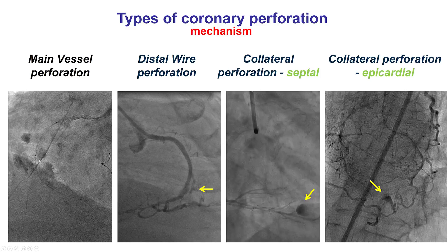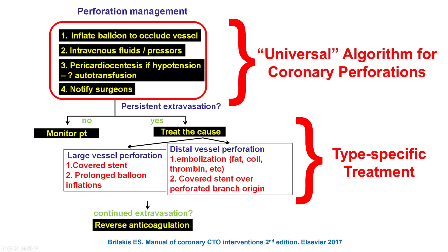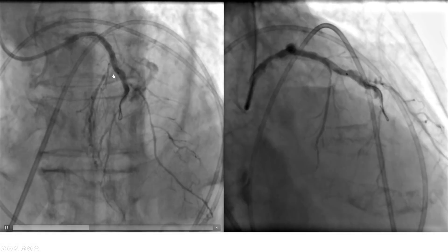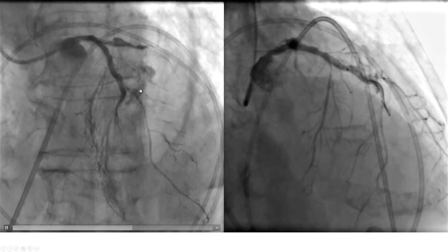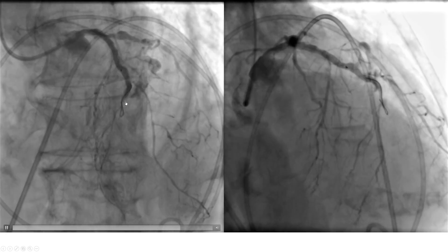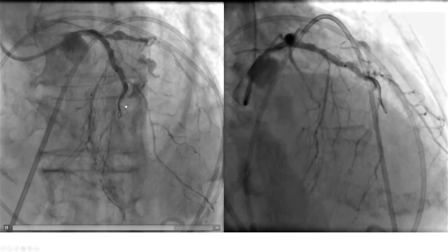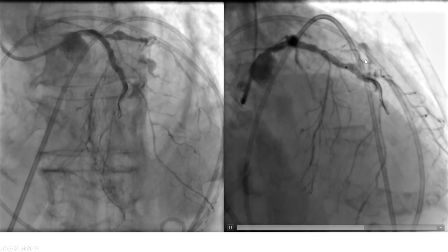At this point we had a main vessel perforation. Initially we thought it was from the wire, but retrospectively it may have been because of stent placement into a diffusely diseased and calcified vessel. Treatment is to inflate a balloon to occlude the vessel, perform pericardiocentesis for tamponade, and notify the surgeons — who had already declined surgery. When balloon inflation did not seal the perforation, it eventually became apparent the extravasation was coming from the LAD, not the diagonal, at the distal edge of the previously placed stent — a fairly significant perforation with continued extravasation.